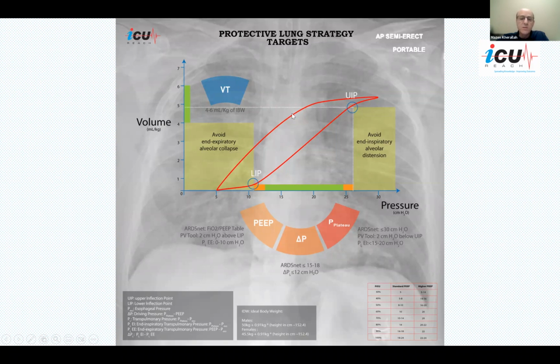This way we provide protective lung strategy with low tidal volume that prevents volutrauma, limited pressure that prevents barotrauma, and appropriate PEEP that prevents atelectrauma. And of course, the driving pressure also prevents volutrauma and barotrauma.